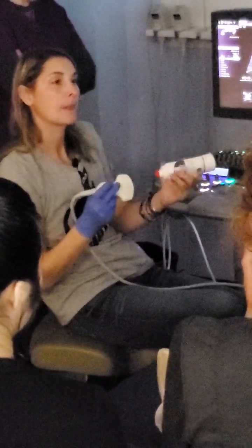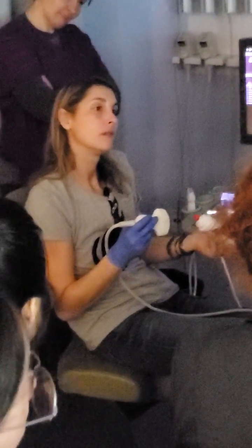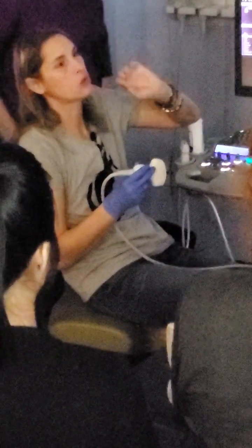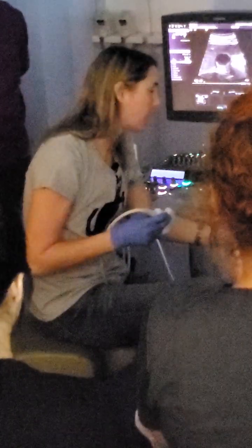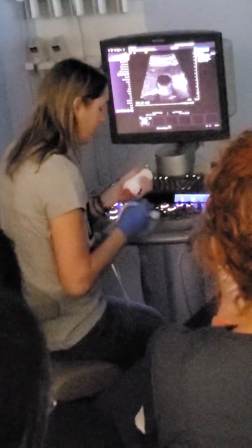And the reason you know for the neck that you're in the neck transverse is because of the main lobar fissure. And the neck always points towards the portal vein. So whatever part of your gallbladder is close to that portal vein is going to be the neck. And then we're going to have her roll up onto her side, facing away from us. Do our LLDs. So we'll do sag, gallbladder, LLD. This is one of the few times that we annotate a position change.